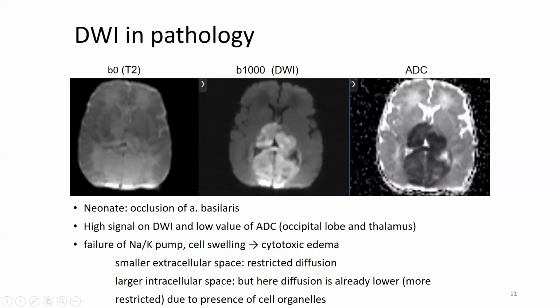Well, just see it as if I had couscous, and I just wait a long time, and the couscous is all swollen, and there's hardly any water left. Or if you have macaroni and you cook it, and you didn't put enough water in, then oh, my water is gone. So the whole extracellular space between the cells is gone.